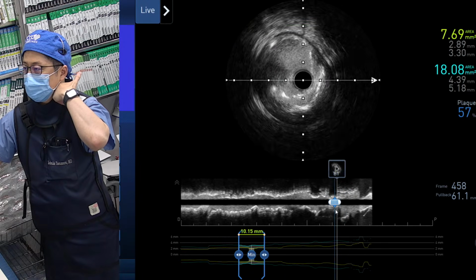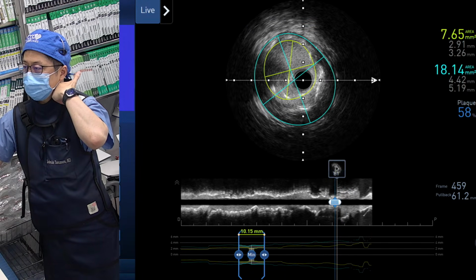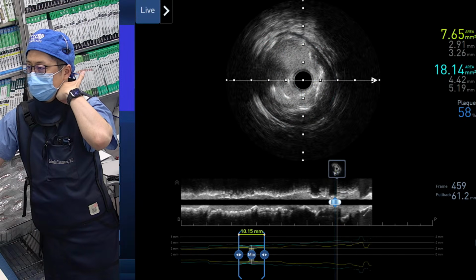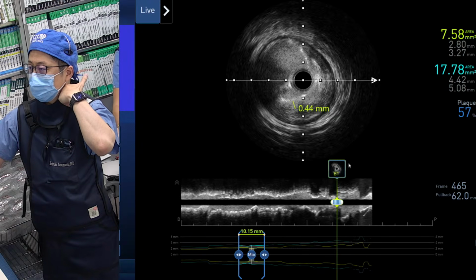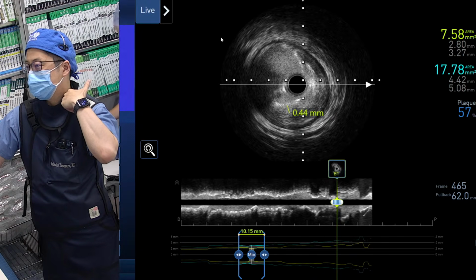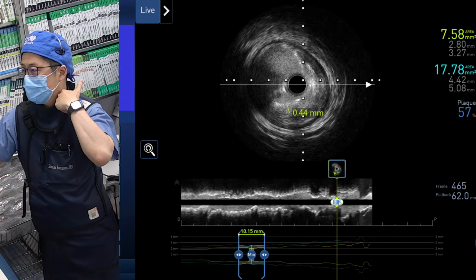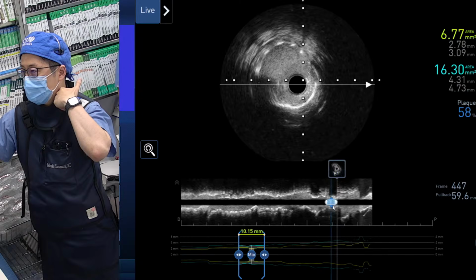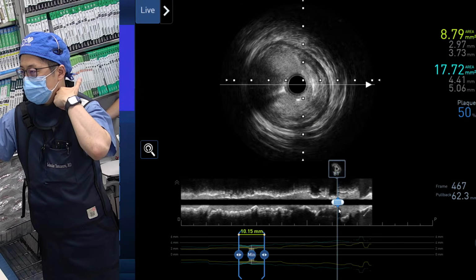Just the upper limit. Yeah, but can you explain the definition of malapposition based on IVUS criteria? Yeah, it's true. Based on OCT, more than 0.4 and a longitudinal length of about 1 millimeter would be a major malapposition. This is by IVUS, 0.4. It's 0.4.